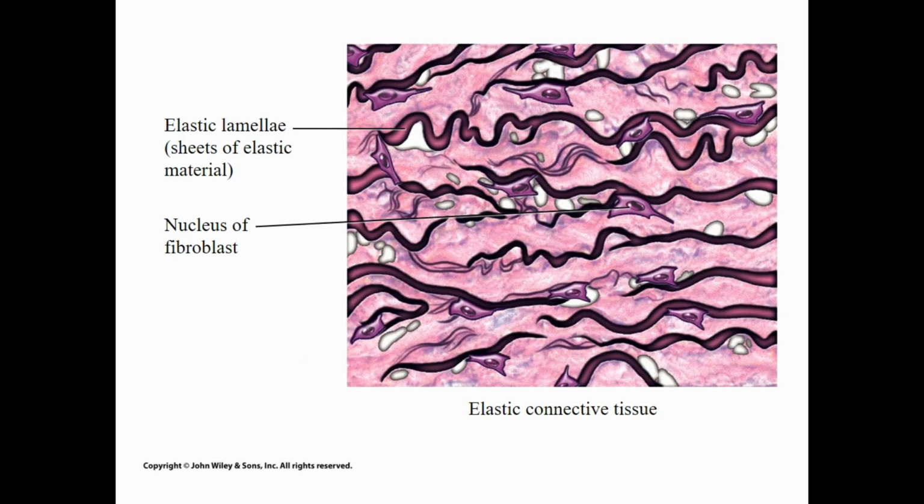Then here is the artistic version. You can see those elastic fibers all nice and kind of lying in order and running in the same direction.